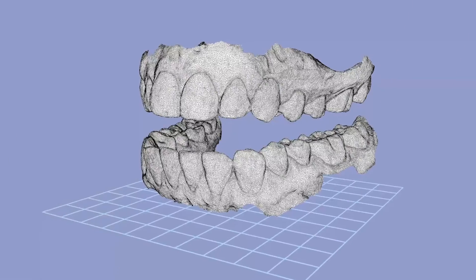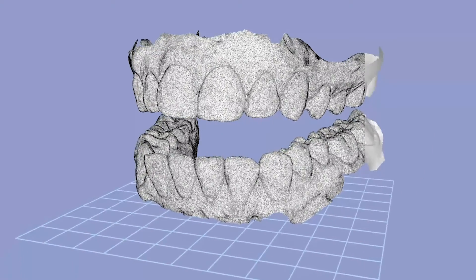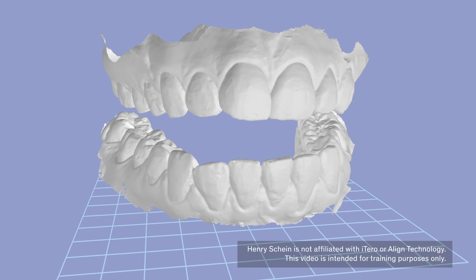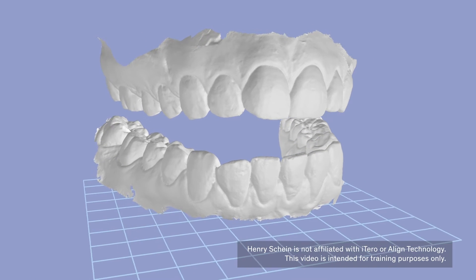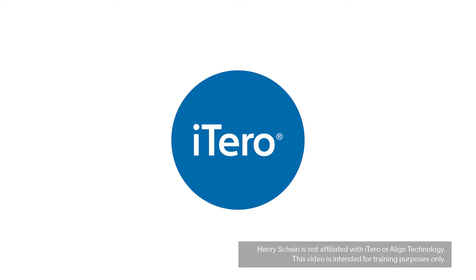If your clinic is already using an iTero scanner, you will be able to scan your patients and upload the STL files to DDX. The iTero software must include the orthodontic module.